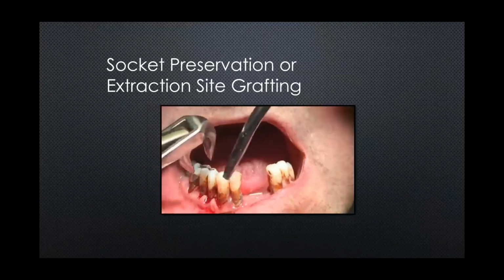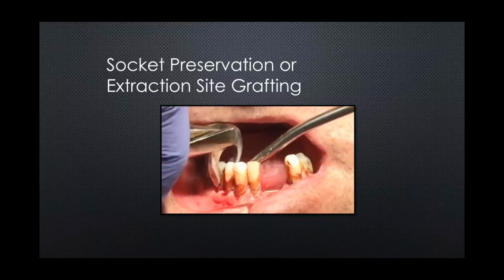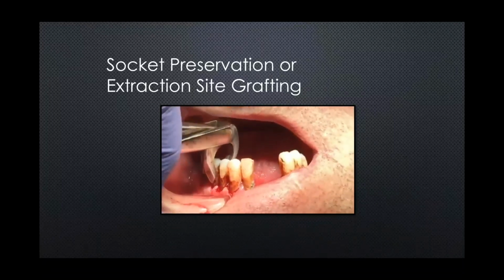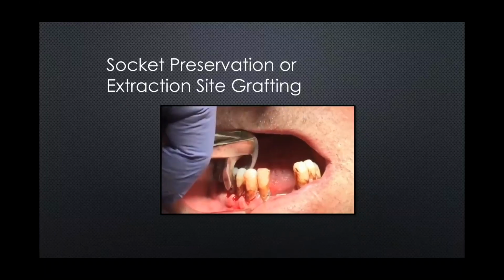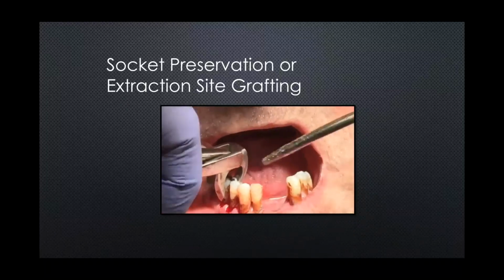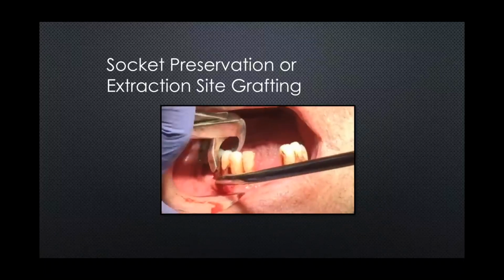This is a gentleman who actually had radiation. He had some hyperbaric, and we decided to take his teeth out. We decided we were going to do a full arch on this particular person, and we went ahead and took the teeth out a couple at a time because we were worried about osteonecrosis. We did some bone grafting, we made a temporary denture. It turned out to be really good, and he didn't need to come back to do the full arch.